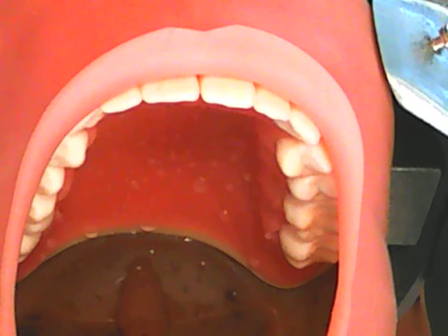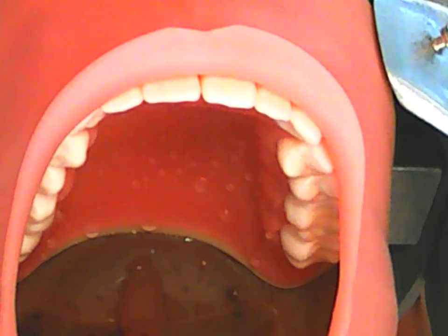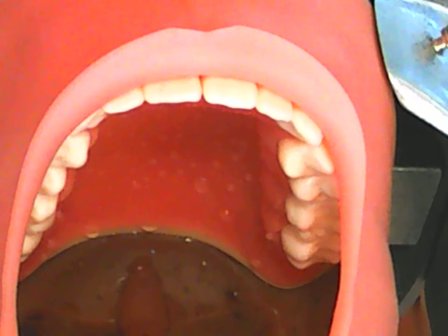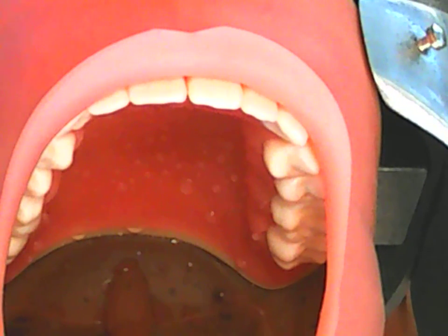Firstly, we want to involve the client and ensure client comfort by asking if they're familiar with dental dam, if they've had it before. If they have, a quick explanation or reminder will do.